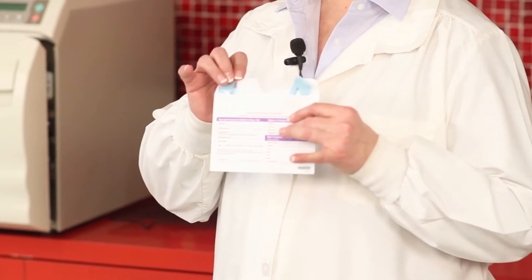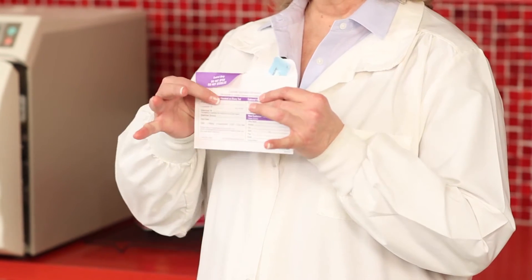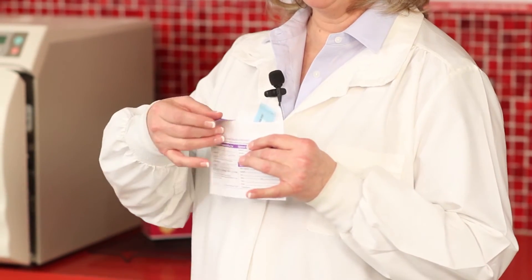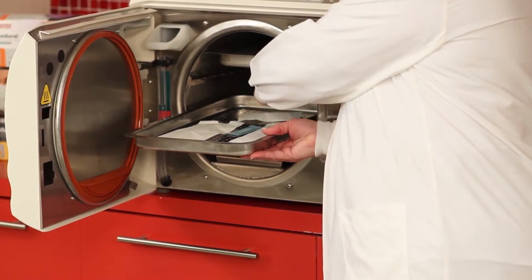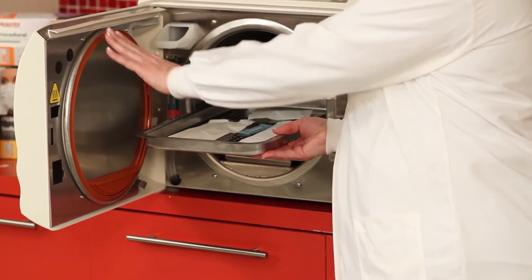When you receive a test envelope, one side is actually going to be closed. This is the control strip side because you don't want to run it through your sterilizer. The other side is open. That spore strip is going to be placed in the most challenging part of the sterilizer — in the center or the back corner above the drain, or on the bottom tray in the front by the door.